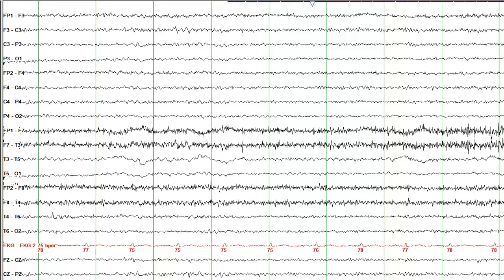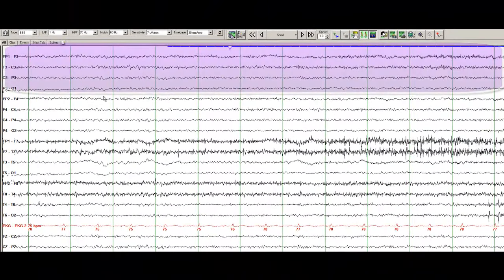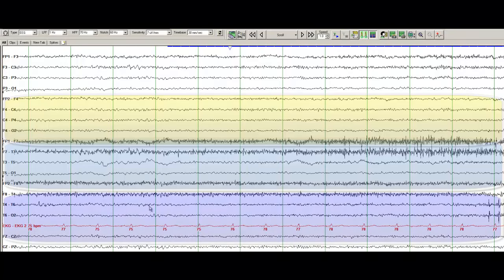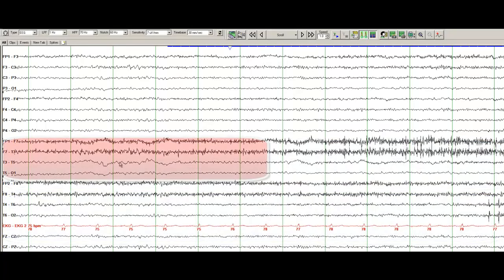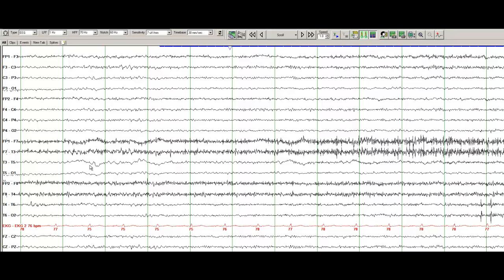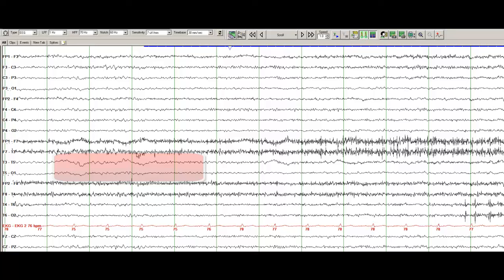Like any neurological examination, when you're reviewing an EEG, compare the left side of the brain to the right side. So this is the left parasagittal central parietal area, and this is the right parasagittal area. Then you compare the left temporal with the right temporal. Something that really stands out on this EEG — if you look at channels T3 and T5 — this is slow activity. We call it slow because the number of waves per second are fewer compared to the right temporal head region. That slowing persists in the left temporal head region, so right from the get-go you get an idea that there is something abnormal in the left temporal head region.